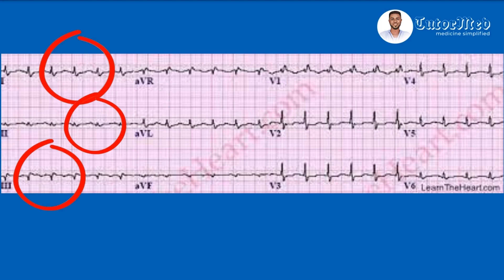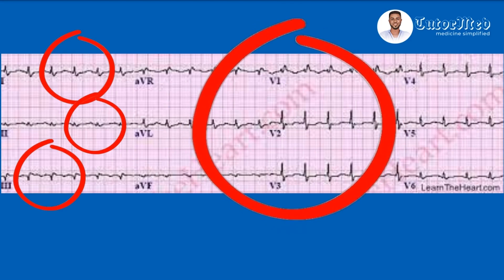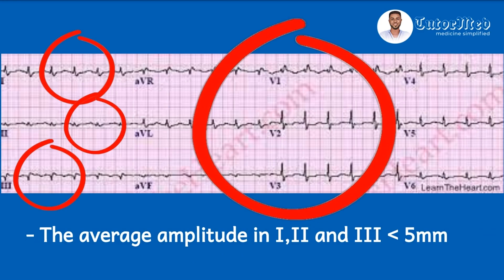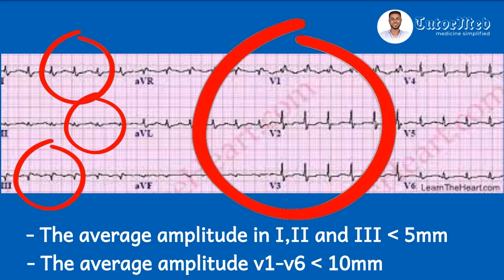Now checking the precordial leads V1 to V6: look at V1 to V3 — none of the QRS complexes occupies two big boxes, which is 10 millimeters. It is the same for V4, V5, and V6. This fits the low voltage criteria using the precordial leads. The average amplitude in leads I, II, and III is less than five millimeters, and the average amplitude in leads V1 to V6 is less than 10 millimeters — confirming this is a low voltage ECG.